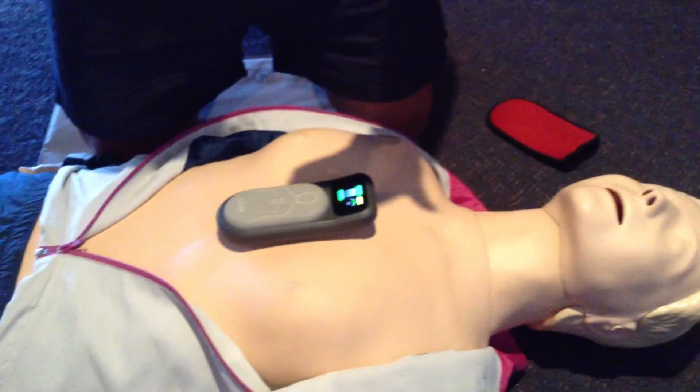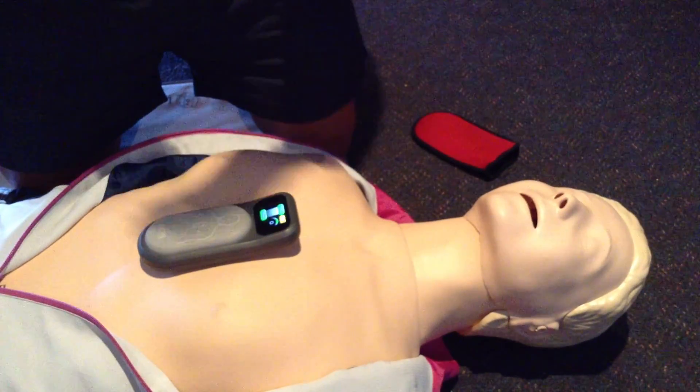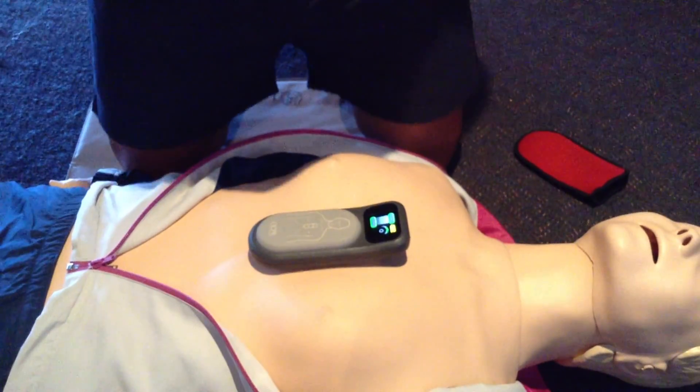I've now positioned the CPR meter on the chest of the mannequin and turned the device on. I'm going to assume my normal hand position on the chest of the mannequin, which is center of the sternum. I'll give you a bit of a live demonstration of how the device works.